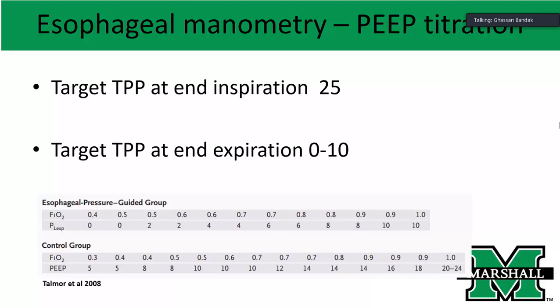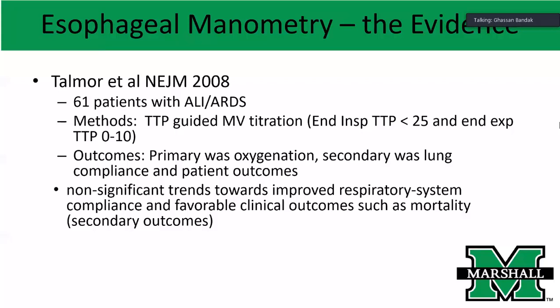But in this setting, you don't care or you don't think you're causing harm because this pressure that you're measuring from the airway, part of it is not causing harm on the lung. Part of it is going to overcome the effect of the morbid obesity or the massive ascites or abdominal compartment syndrome, etc.